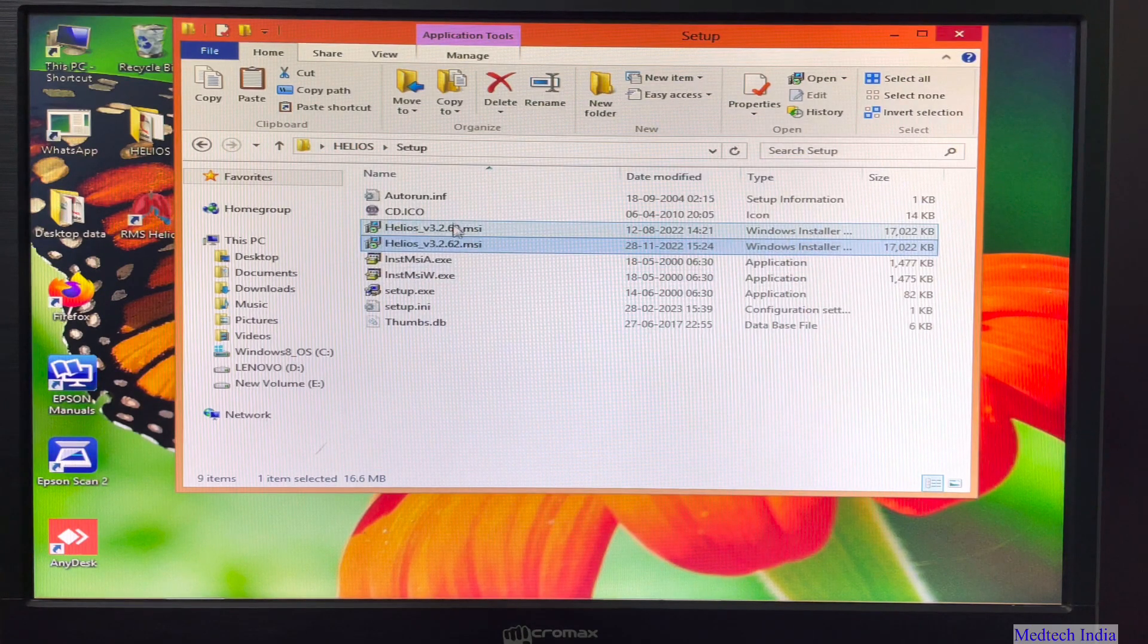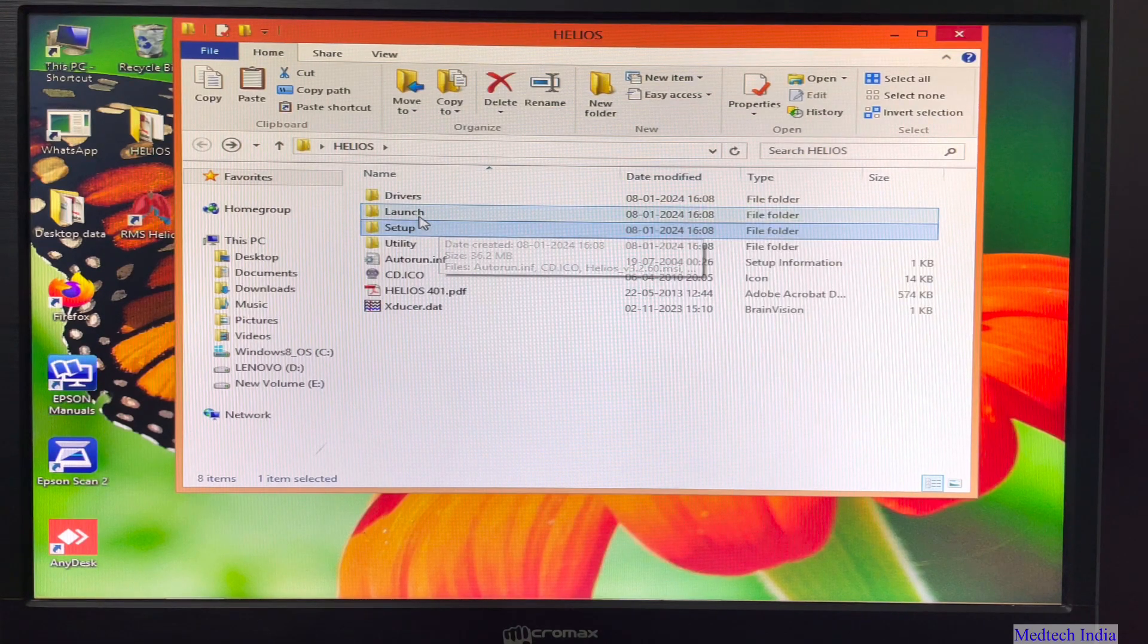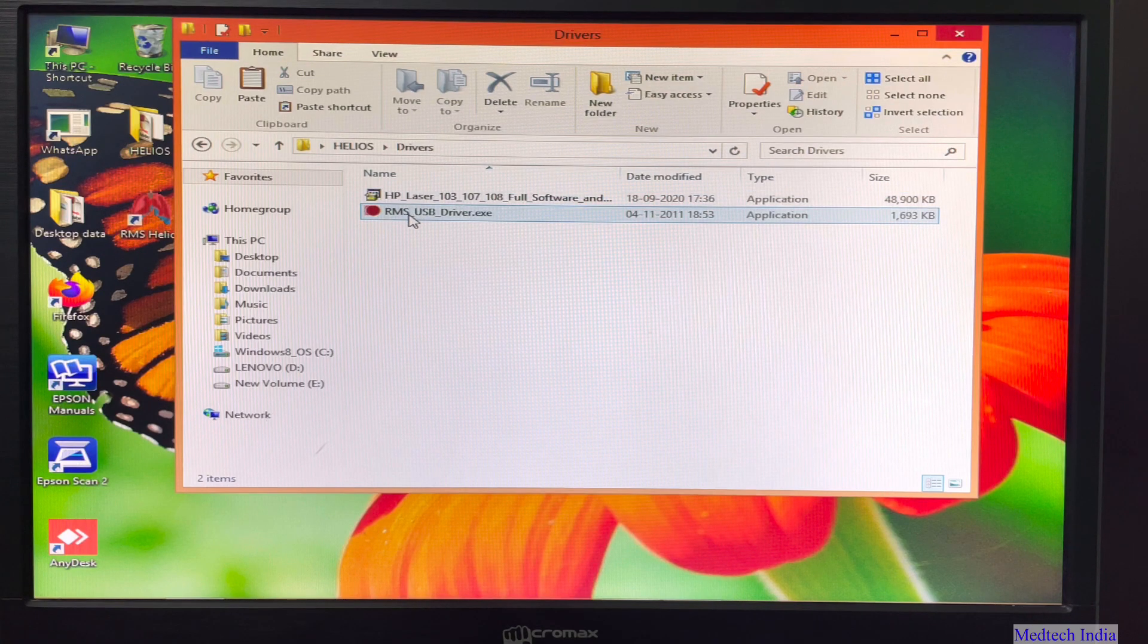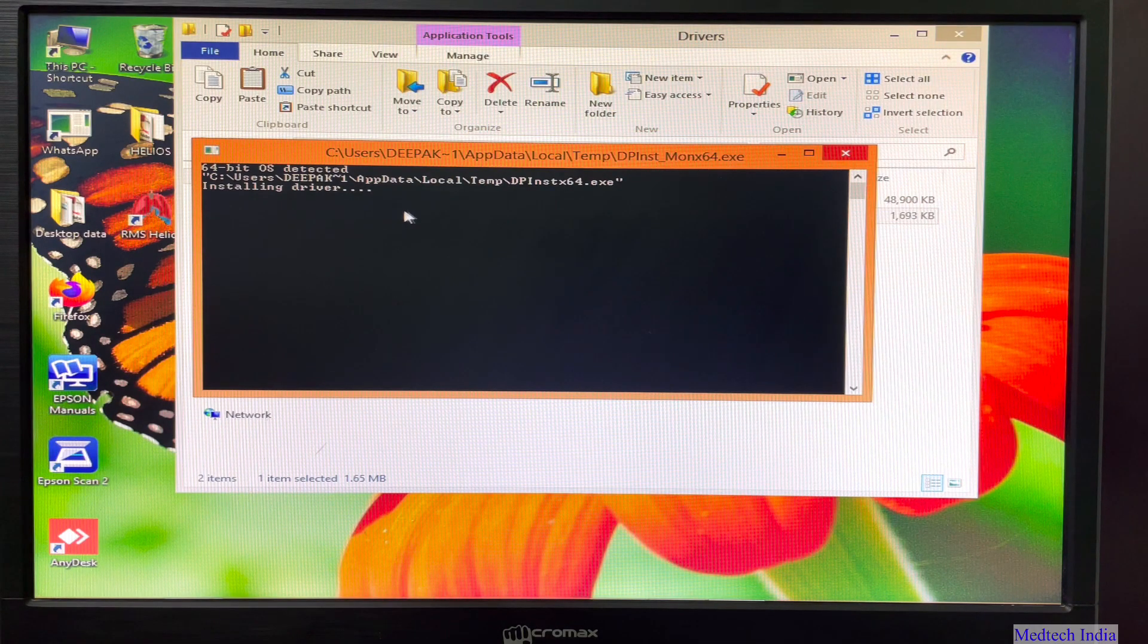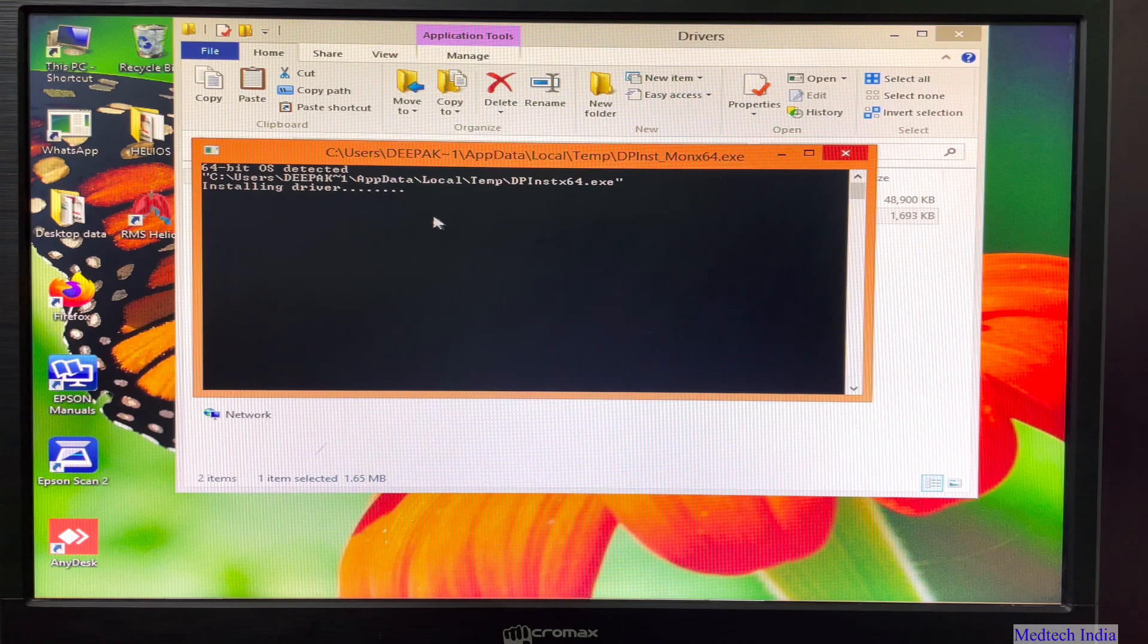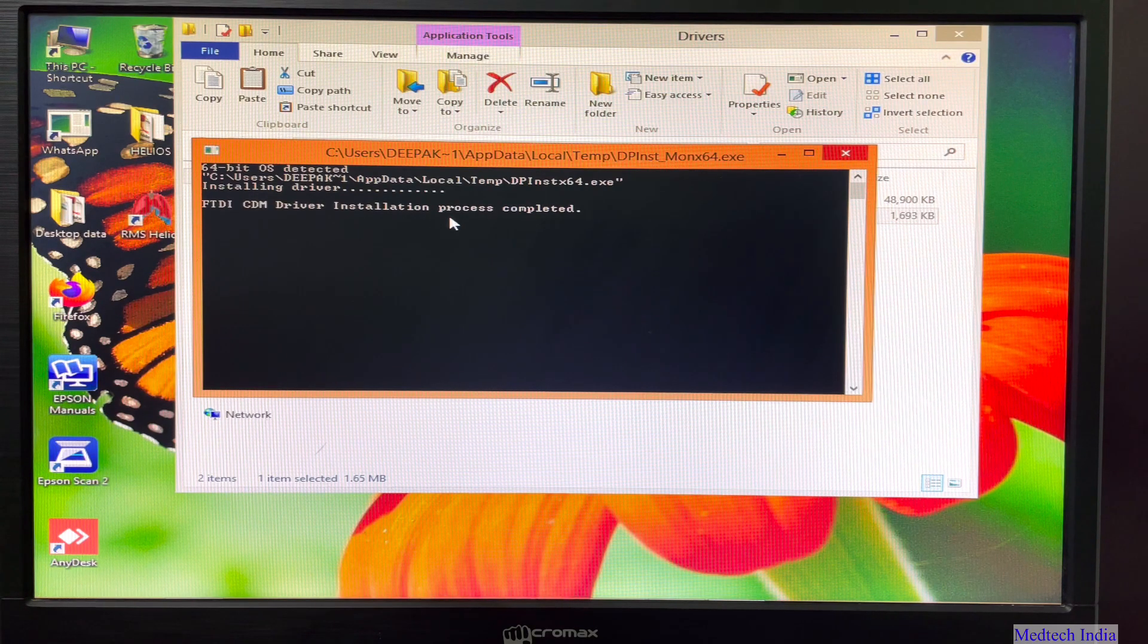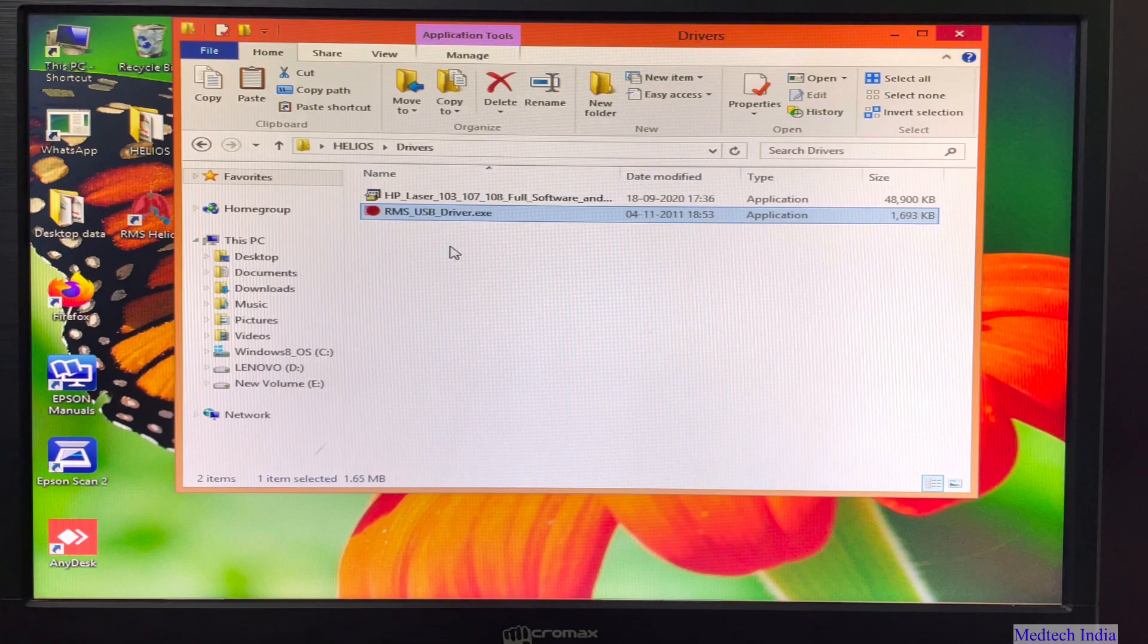Now we will install drivers for USB. For that, we will go back to drivers in Helios folder. We will open that folder. We will get one RMS USB drivers. Let us double click on that. After clicking, it will automatically start installing drivers. In the end, we will get message FTDI CDM driver installation process completed. It means RMS USB drivers has been installed now.